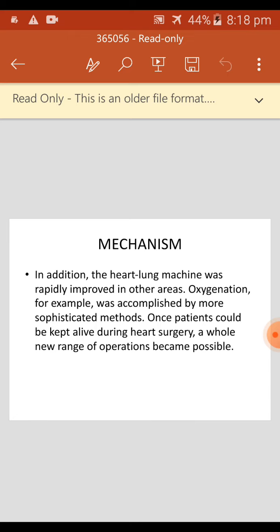The oxygenator consists of a cylindrical glass vessel of 15 cm internal diameter and 38 cm length. 80 to 100 stainless steel discs of 0.6 mm thickness and 14 cm diameter are mounted axially with 3 mm spaces between discs. The shaft on which the discs are mounted is hollow and is supported by 3 ball bearings at the end. The oxygen is fed through the axis of the shaft and enters the oxygenator through the distributing aperture on the circumference of the shaft.